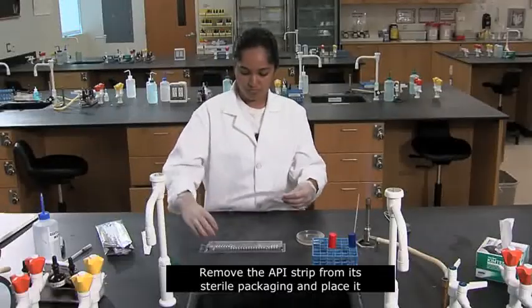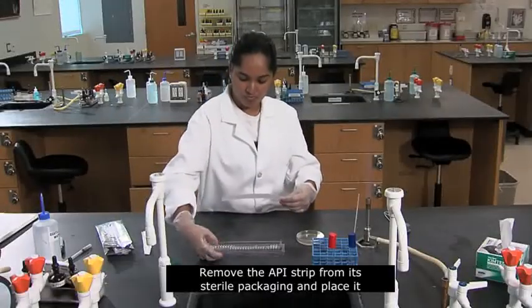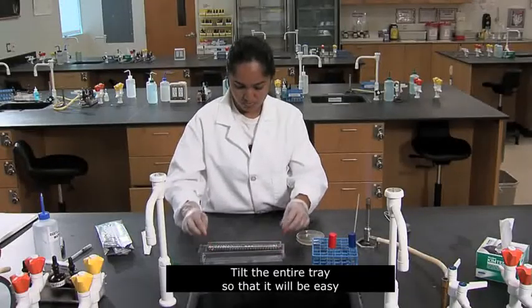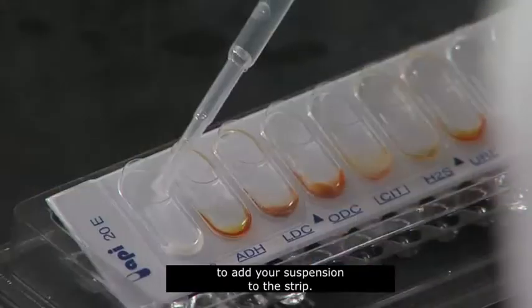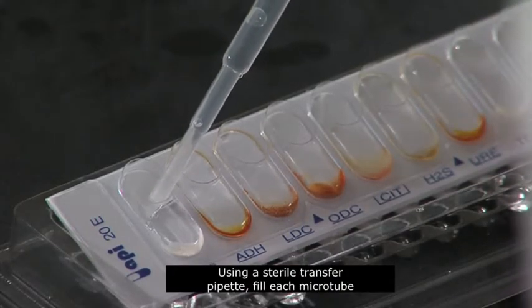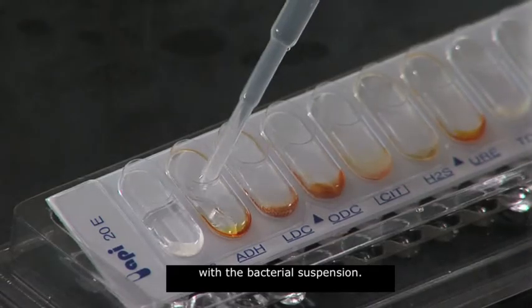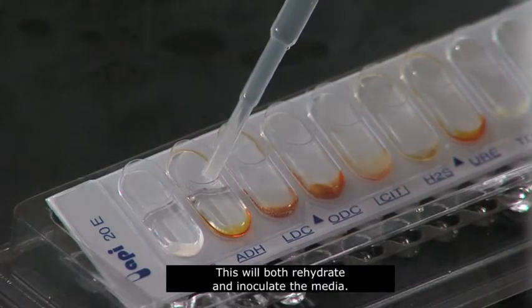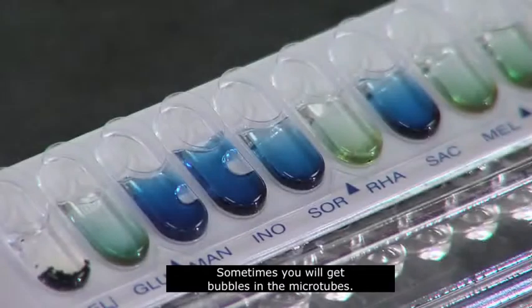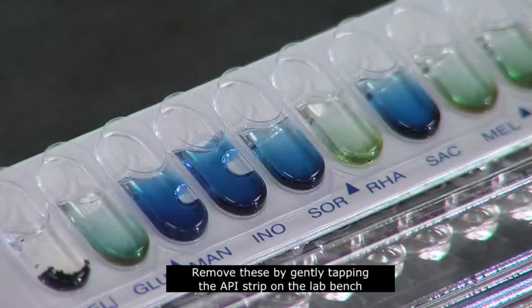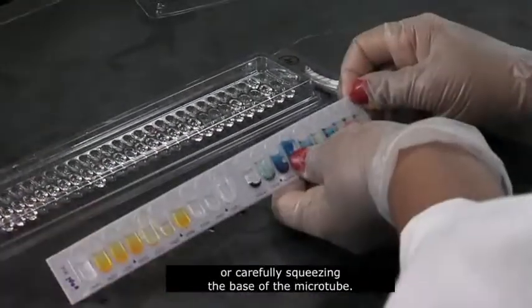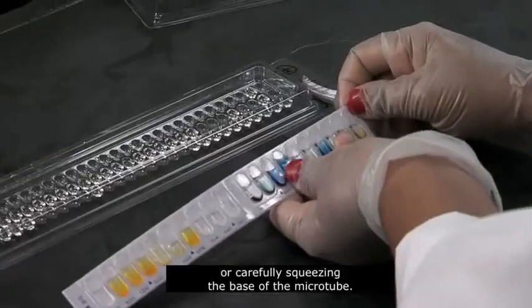Remove the API strip from its sterile packaging and place it in the filled humidity tray. Tilt the entire tray so that it will be easy to add your suspension to the strip. Using a sterile transfer pipette, fill each microtube with the bacterial suspension. This will both rehydrate and inoculate the media. Sometimes you'll get bubbles in the microtubes. Remove these by gently tapping the API strip on the lab bench or carefully squeezing the base of the microtube.